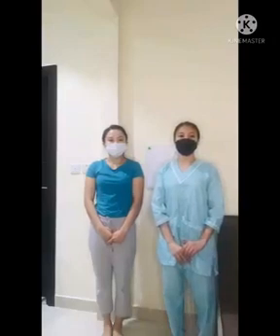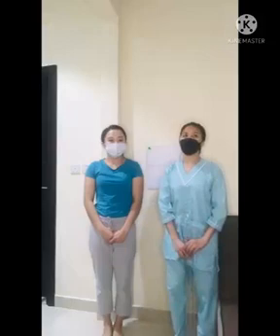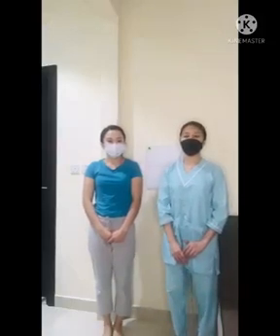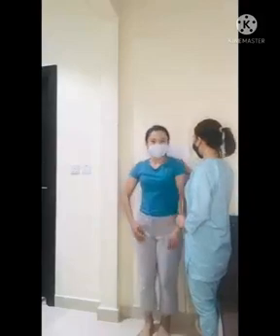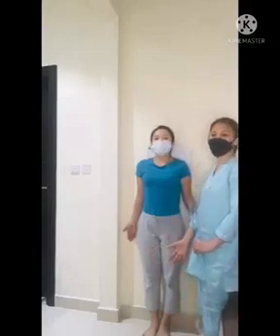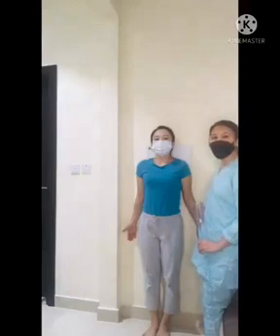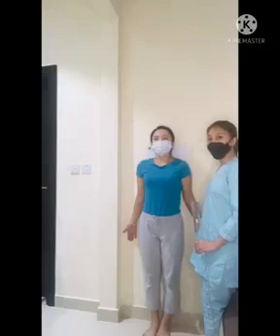So, the first one that we're going to do is the AP clavicle. We're going to use the image receptor 10 by 12, the secondary marker and meter stick. So, instruct the patient supine or upright in AP projection. Yung hand po ng patient po natin is dapat po siya nakastand ng ganito. Place the arms along the sides of the body, posterior part of body in contact with IR.